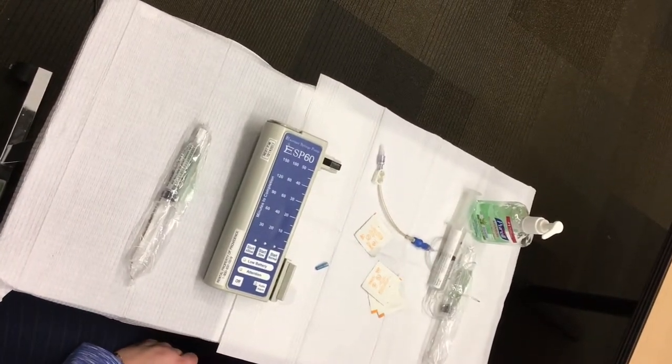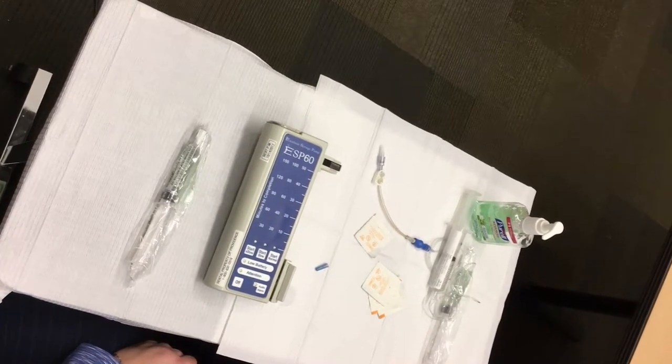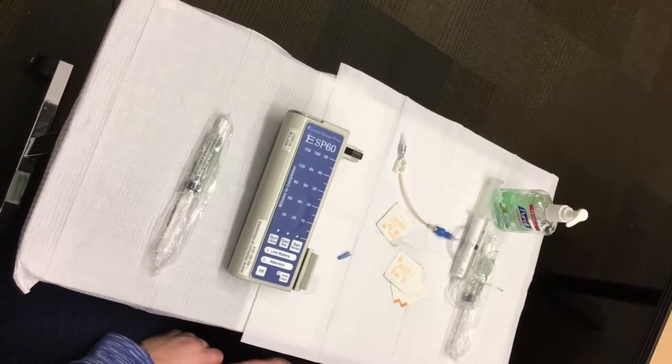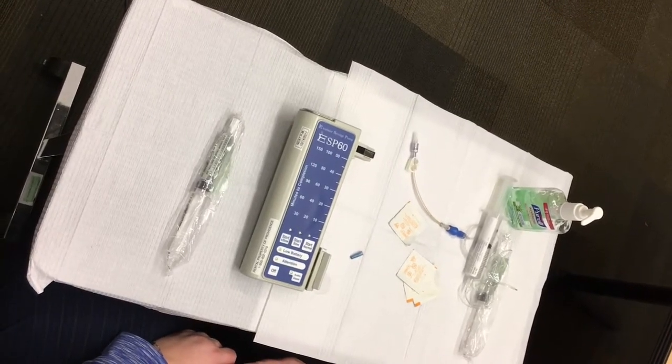Your Providence Infusion RN has reviewed this process with you, so please refer to the specific individual instructions they provided. If you have any further questions, please call us so that one of our IV nurses can answer any questions you may have.